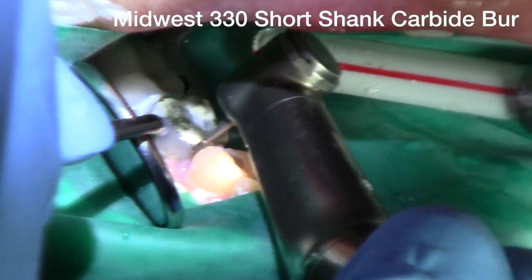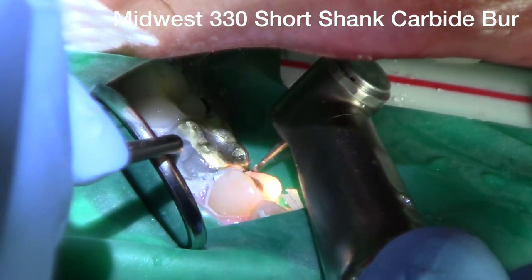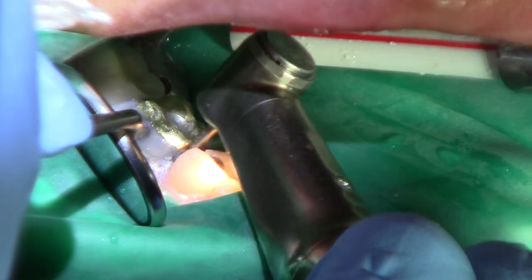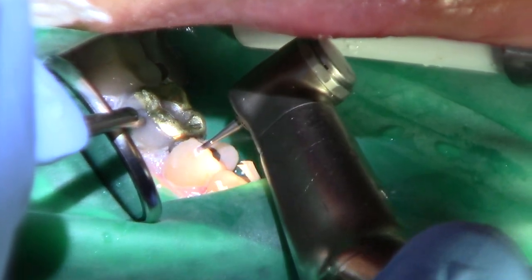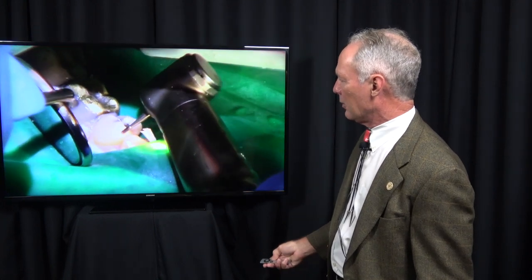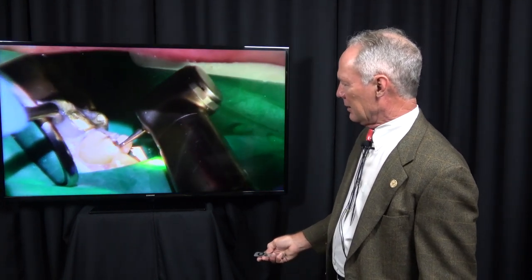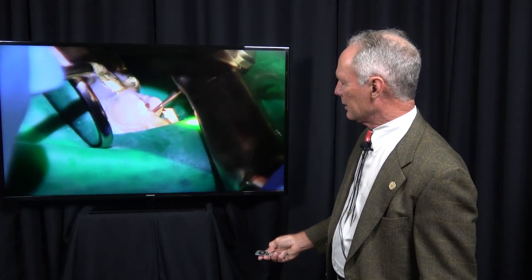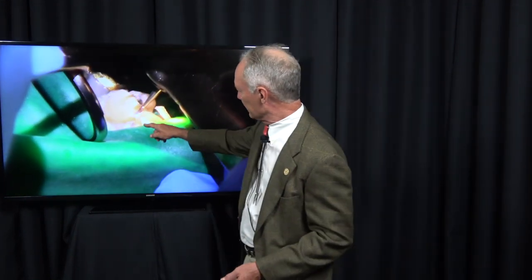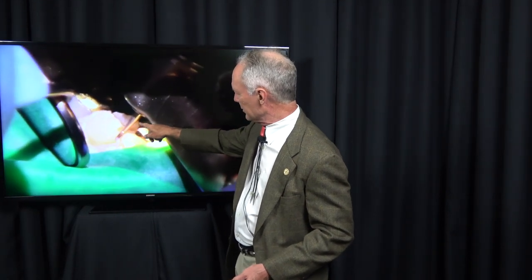This is a 330 short shank carbide burr and I'm prepping interproximally. I'm keeping the preparation into the bicuspid. This burr is two millimeters long and so I want about a millimeter and a half of occlusal reduction. I'm placing most of the burr into the tooth as a guide for occlusal reduction.